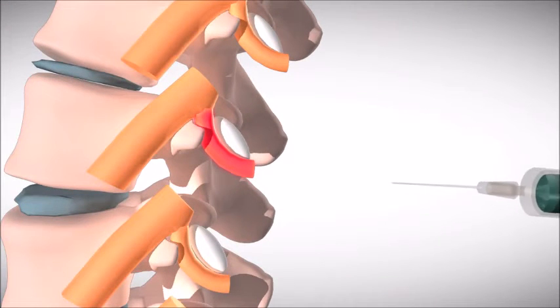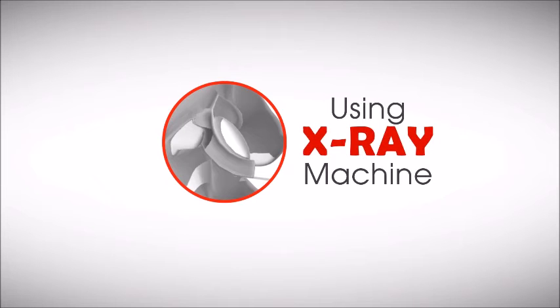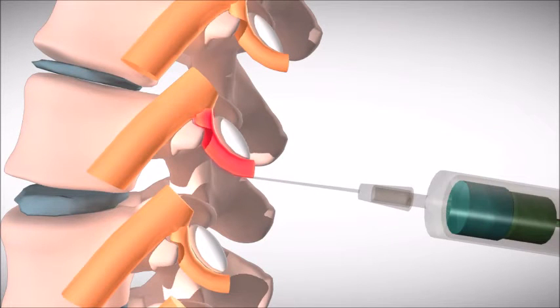He will then use a special x-ray machine to guide the needle close to the lumbar medial branch. A small amount of local anesthetic is then injected around the nerve.